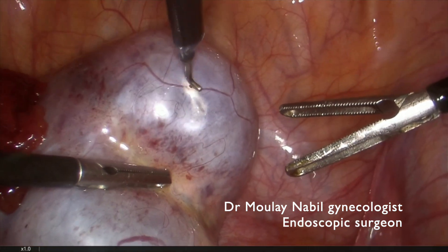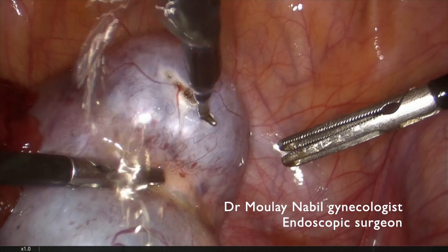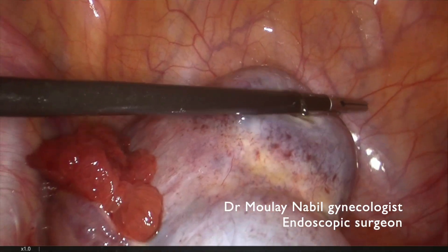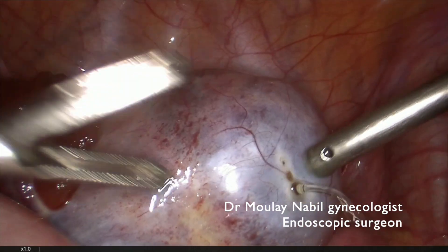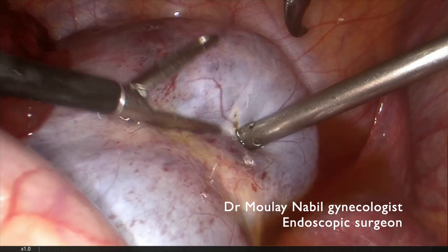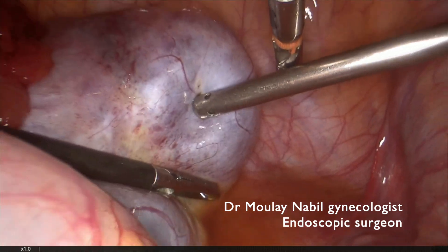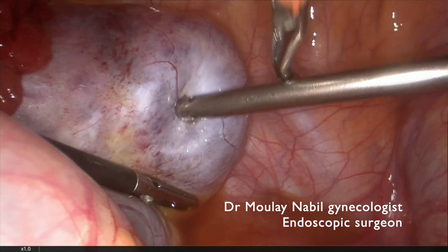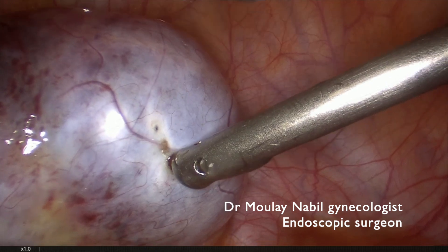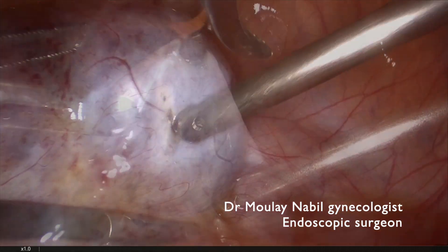We will open the cyst and remove the liquid inside to decrease the cyst volume. The assistant used a 5mm sucker, and there was 300cc of liquid.